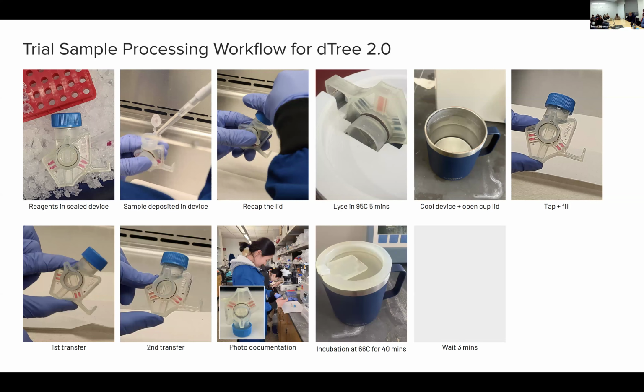How do you store your reagents? How do you bring them to the field? Yeah. That's something Anesta is working on right now. Currently the fresh or wet version of the reagents requires storage at -20 degrees Celsius. We have a couple of different options for lyophilizing the reagents, which means removing the water out of them. It's mainly the enzyme that's most sensitive to this, so once there's no water, there's no medium for the enzyme to become active or denature. What we're hoping to bring to the field is a lyophilized, shelf-stable version of the reagents.